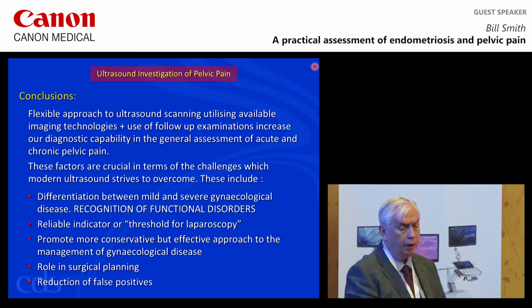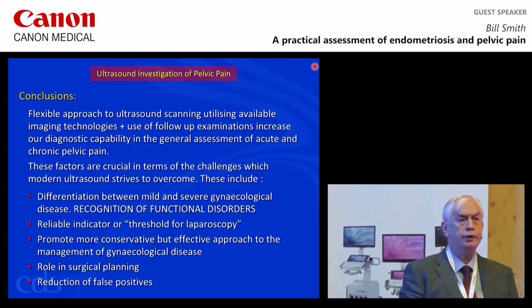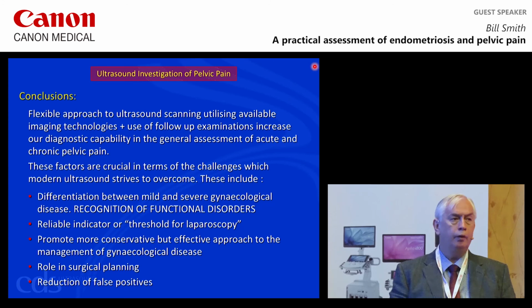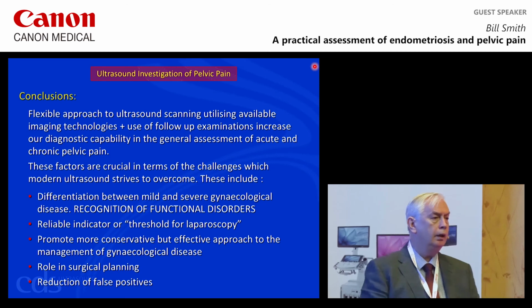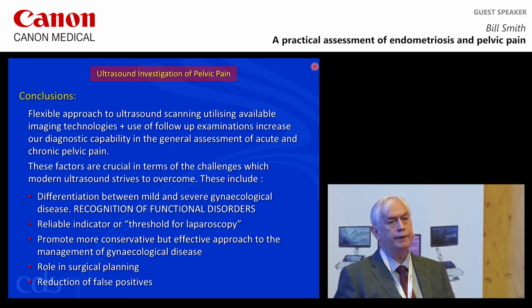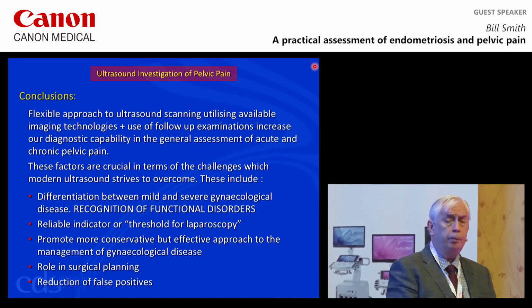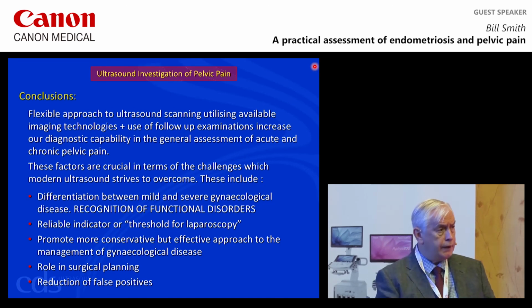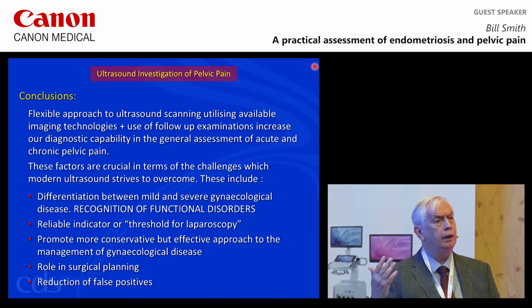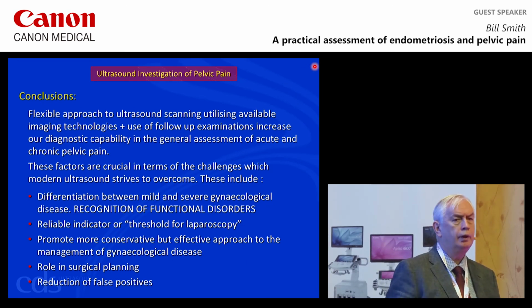So there's a very, very brief introduction to our thoughts, our impressions in terms of using high-quality ultrasound imaging, whether it's 2D grayscale, color Doppler, whether it's 3D, whether it's different scanning techniques, and the value of follow-up scanning. Really, our challenge is to be more precise in our diagnosis and give the referring consultant more reliable information to work on in terms of clinical management.